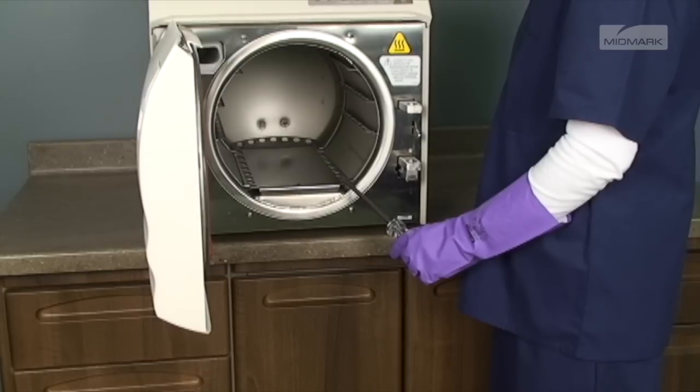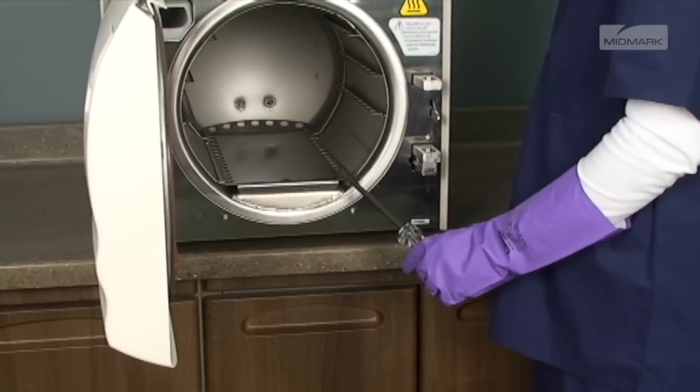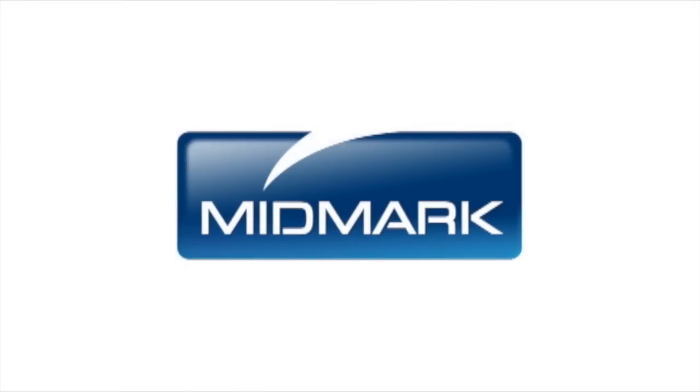Do not run the sterilizer without the tray plates in place. For more detailed information about loading your autoclave, please refer to the M9-M11 installation and operation manual. For further support, contact Midmark Support Services by calling 1-800-MIDMARK or visiting midmark.com.